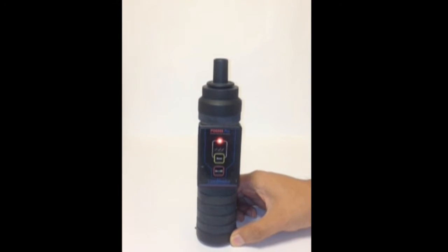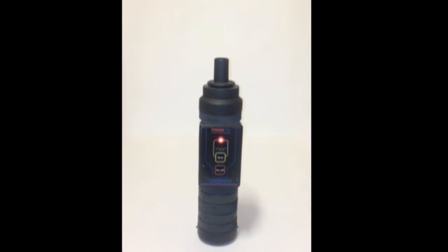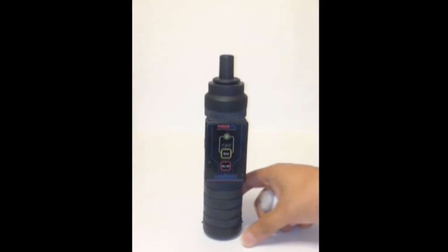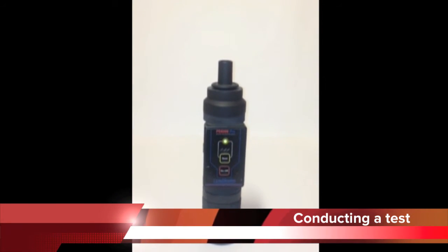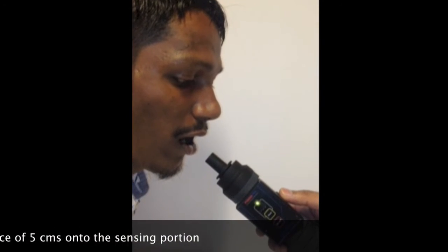The indicator would turn red to indicate that alcohol content has been detected in the breath of the subject. Once the instrument is ready, it will start beeping and the indicator will start flashing green. Green flashes indicate the instrument is ready for operation — please use the instrument only after the flashes turn green. Simply ask the person to exhale lung-deep air onto the sensing portion from a distance of 5 cm for at least 6 seconds. That's how the test is conducted.